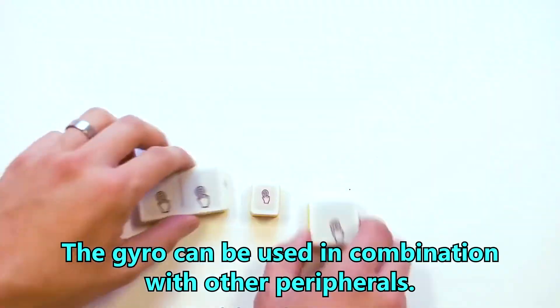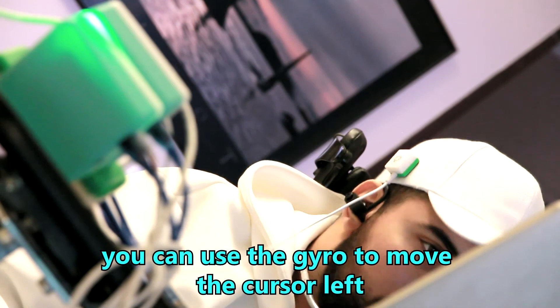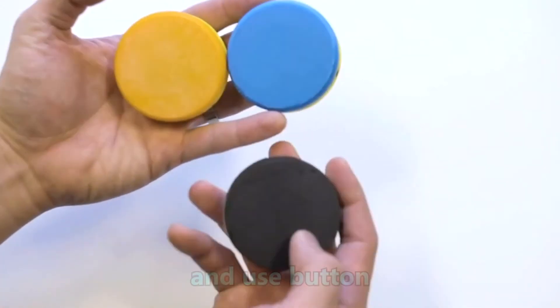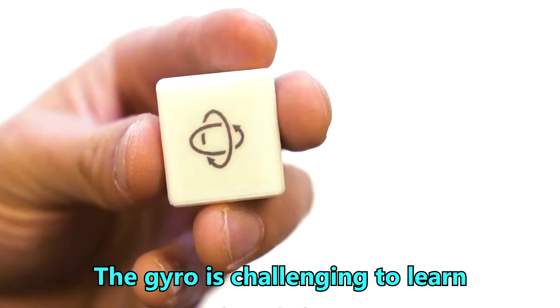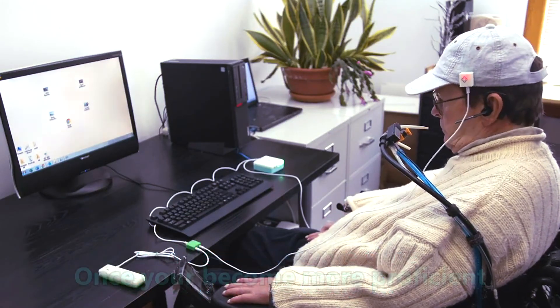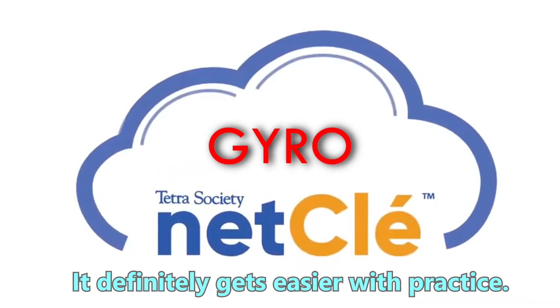The gyro can be used in combination with other peripherals. For example, you can use the gyro to move the cursor left, right, up and down, and use button, joystick, or touch sensors to do right and left clicks. The gyro is challenging to learn, so please be patient and dedicate some time to practice using it. Once you become more proficient, you will be able to move the cursor with smaller head movements. It definitely gets easier with practice.